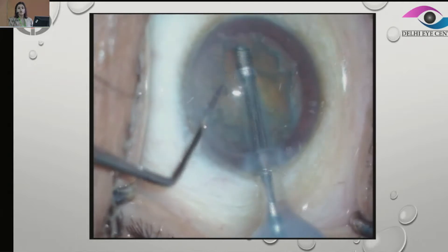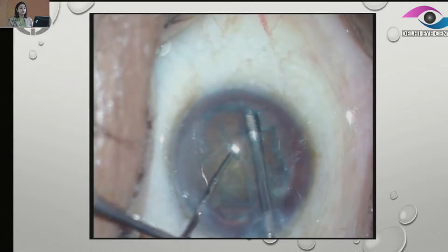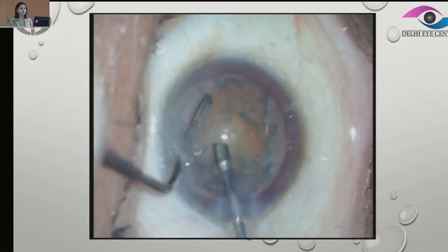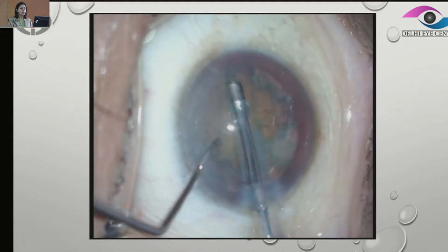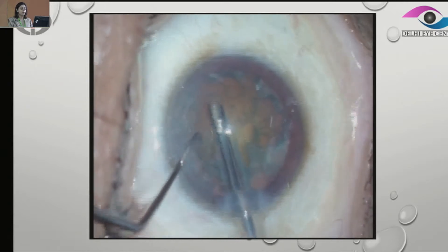We are going in and trying to remove a little bit of the anterior epinuclear plate so that the sticky anterior epinuclear plate is out and it's much easier for us to manipulate the nucleus. Again, we are rotating and trying to aspirate as much as we can and free the nucleus so that we can emulsify it easily and chop it safely.